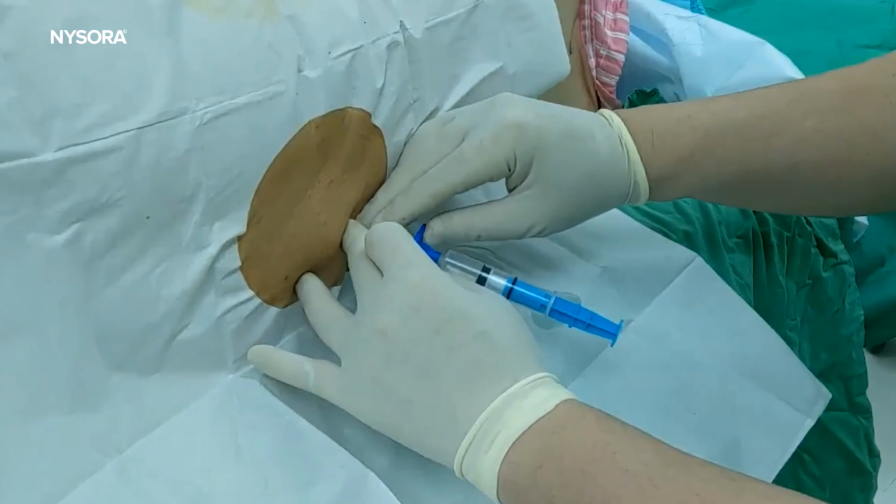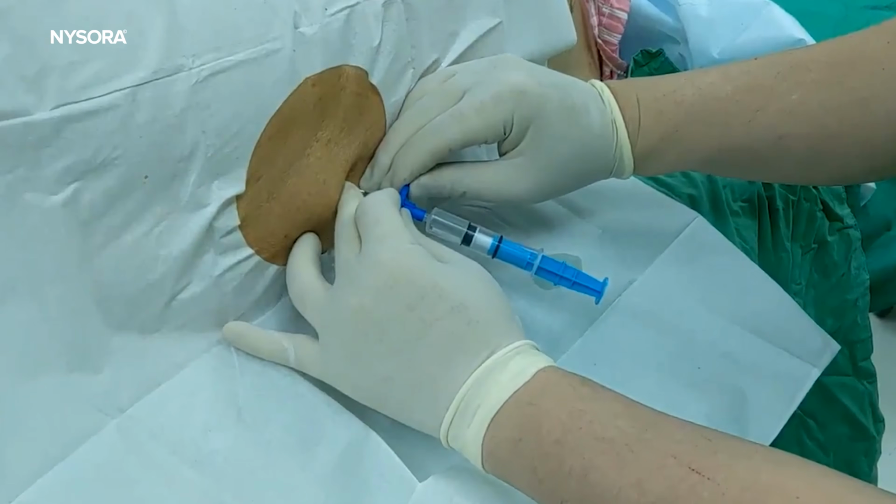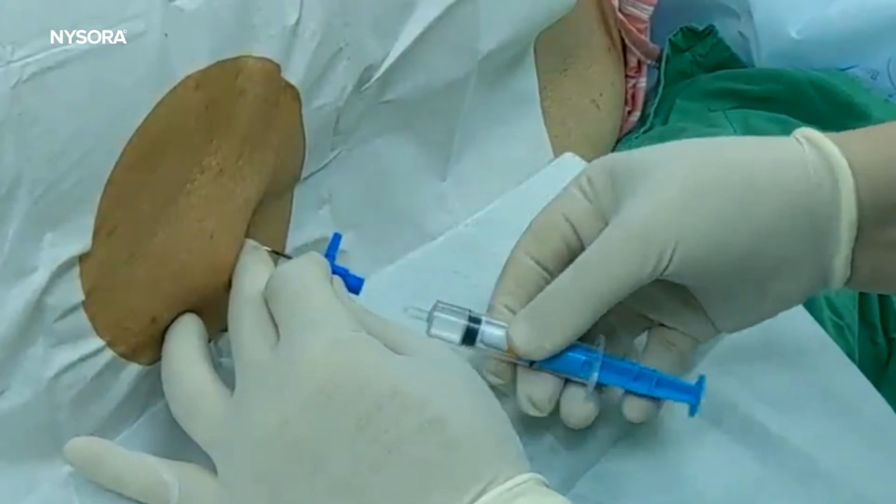I found this new device actually cool and very intuitive. It also does not require modification of the technique and gives students more confidence in a visual confirmation of the loss of resistance. In fact, I think that the objective pressure monitoring may be the solution for difficulties with epidural anesthesia and even increase the use of epidural analgesia in clinical practice.